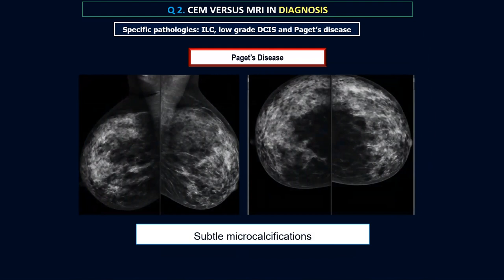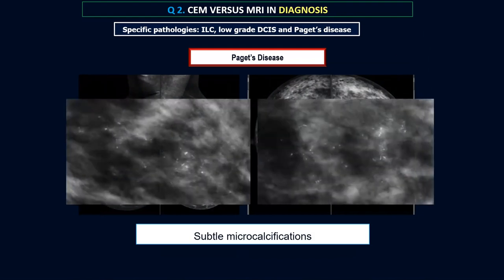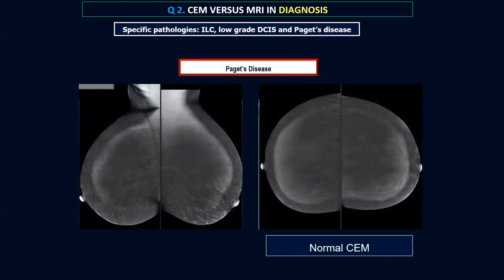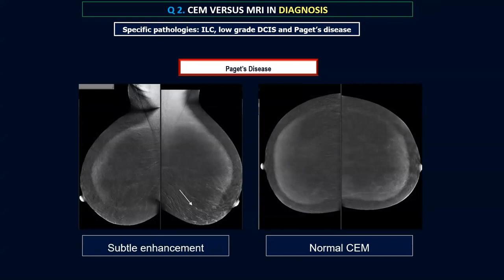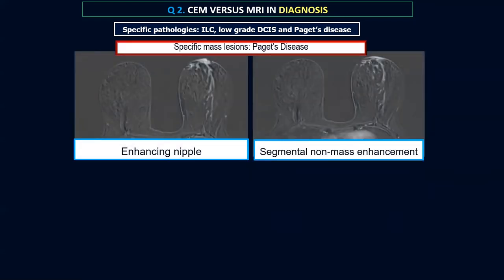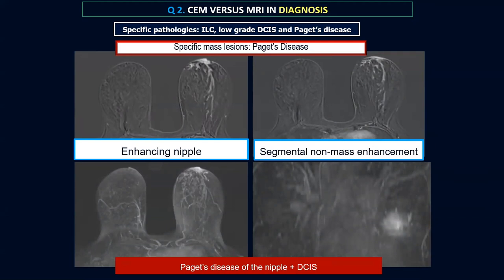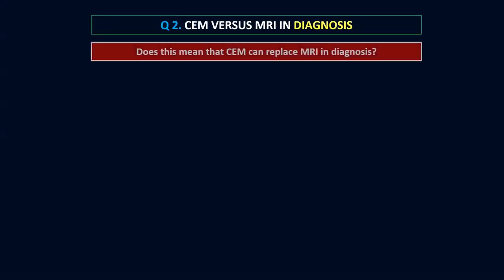Another case: a patient with Paget's disease of the left breast associated with microcalcifications scattered within the left breast. Her contrast mammogram was more or less normal — perhaps very subtle enhancement detectable, but we could not describe the distribution or size. Looking at the MRI of the same patient, we can easily see an enhancing nipple associated with clear segmental non-mass enhancement, which describes the distribution of the associated DCIS with the Paget's disease.